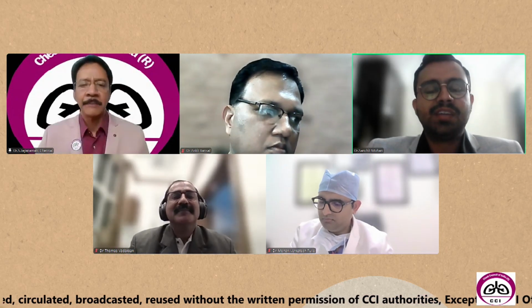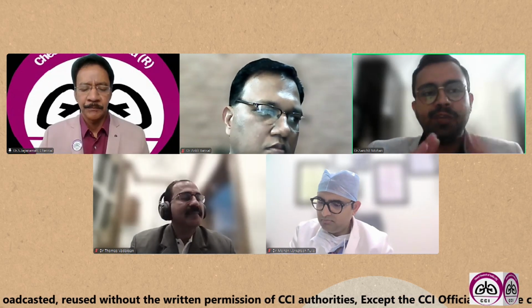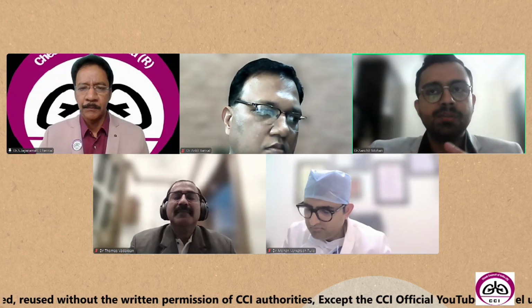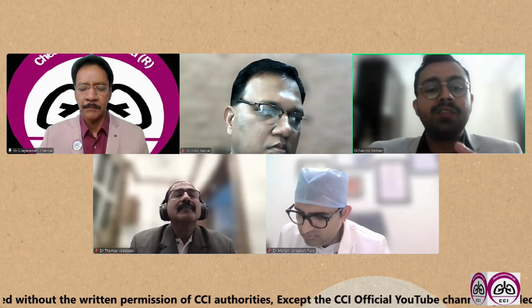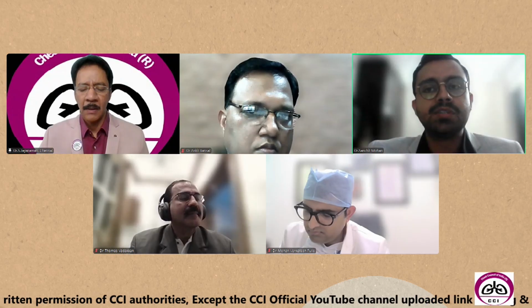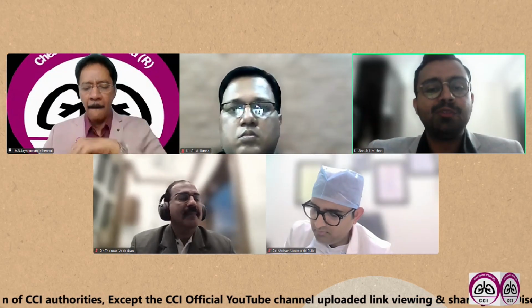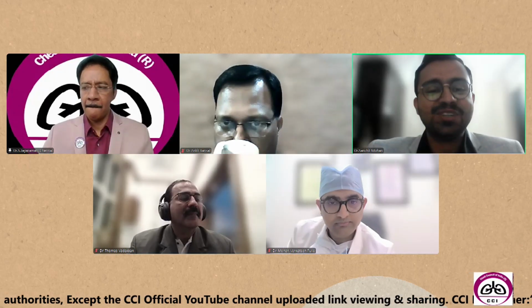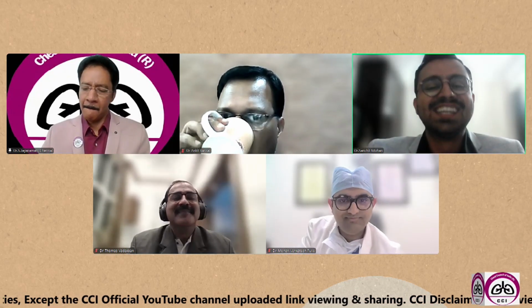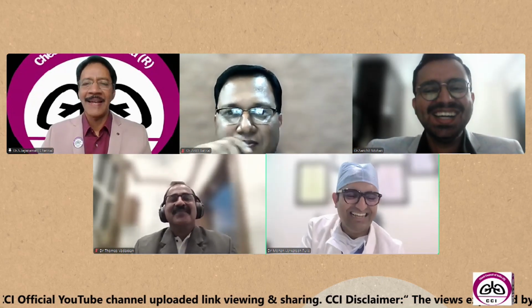Okay, sir. Thank you, sir. If we combine EBUS and EUS-B, I think we can sample most of the lymph nodes. The only lymph node which comes to my mind that will not be sampled through the combined procedure is 3A. So if there is a 3A lymph node, I'll definitely refer the patient to Mohan Venkatesh sir for the rescue. Yeah, always.